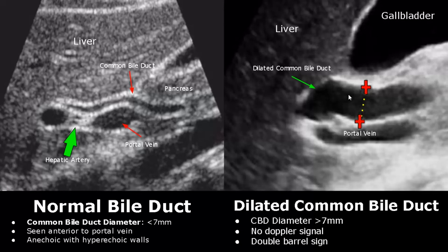This appearance is termed the double barrel sign. It is formed by the dilated duct which is anterior to the portal vein.